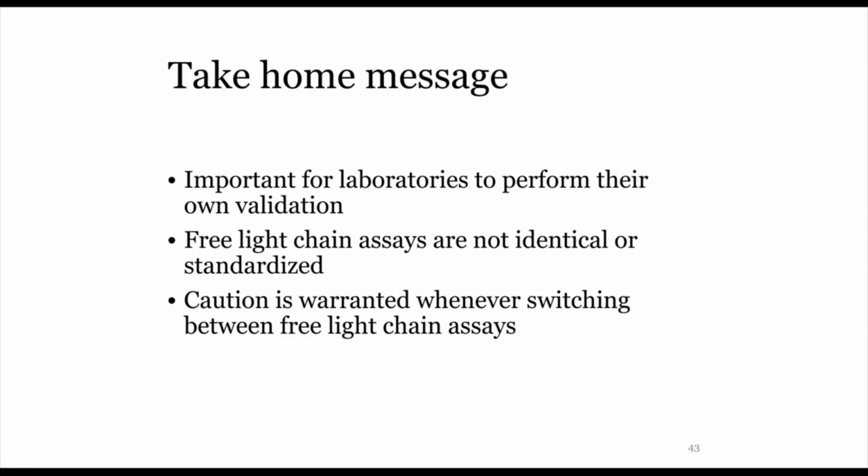And one thing that's very important with the kappa lambda analysis is the actual ratio. And so when you do these on patients and with healthy donors, you kind of see where the issues are with the other assays. And so I think that we dug a little bit deeper, and we did find that there are some aspects where they're not entirely comparable.